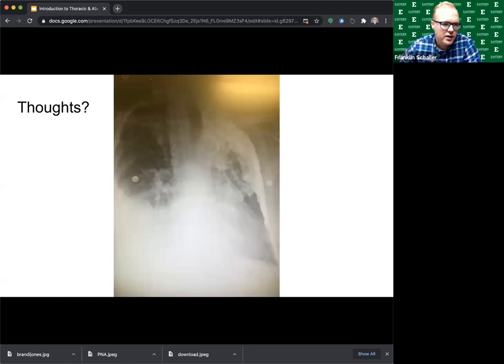So here is another patient I had in clinic, and this patient came in complaining of chest pain. I didn't do a phenomenal job with the history taking, but I got a chest x-ray and this is what I saw. It's not the clearest image, my apologies, but when you look at this chest x-ray, it appears grossly abnormal. There is some type of pleural thickening going on the left-hand side. There almost looks like an angel wing or something. It just looks completely abnormal.